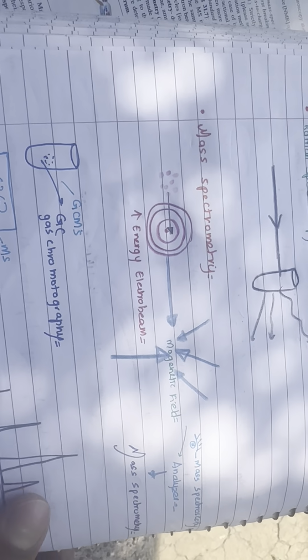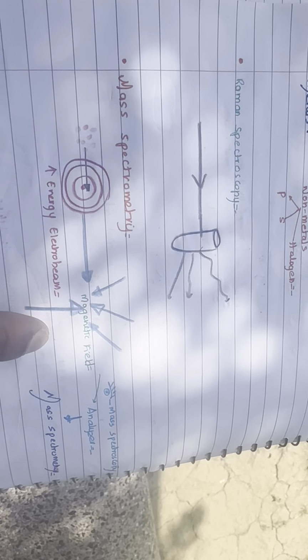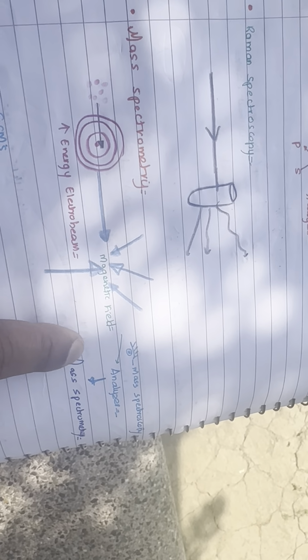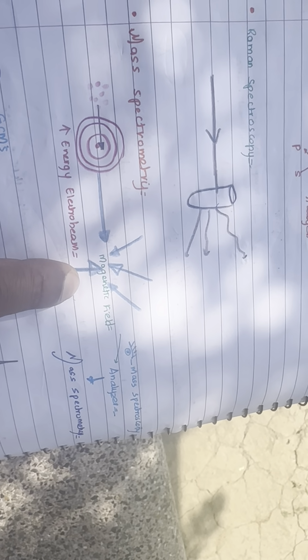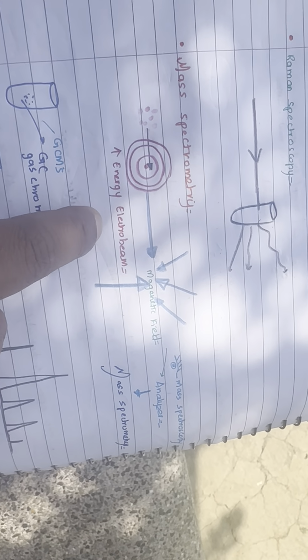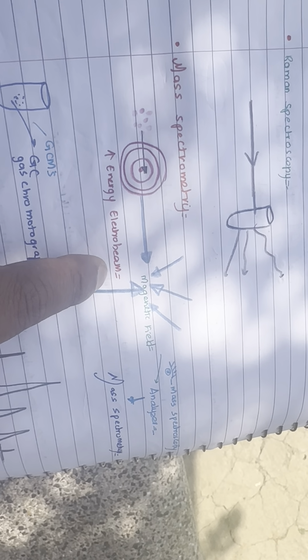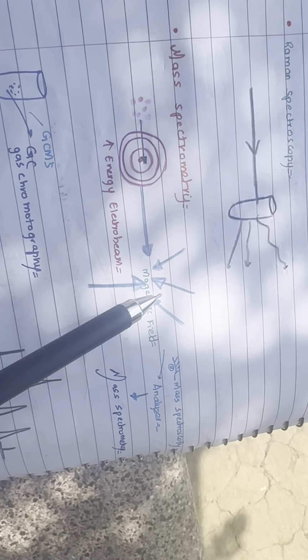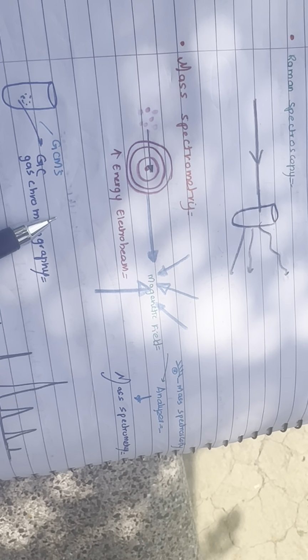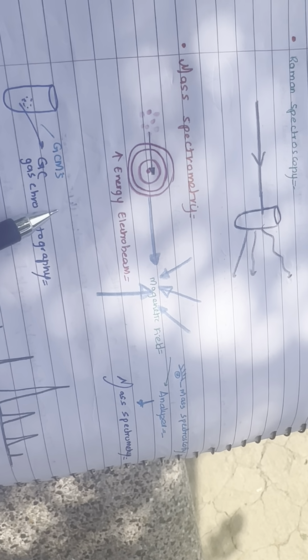Mass spectroscopy is an analytic technique that detects poisons by breaking them into molecular fragments and measuring the mass to charge ratio of each fragment. Strictly speaking, the name is a misnomer. It is the most reliable identification, but applicable only if the sample is pure. In the case of an impure sample, the mixture is subject to fraction separation by gas chromatography. The procedure is more commonly known as GCMS, that is, gas chromatography mass spectrometry. Mass spectrometry remains the gold standard of drug testing.